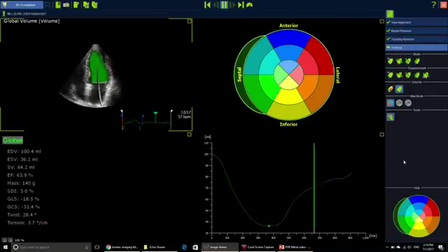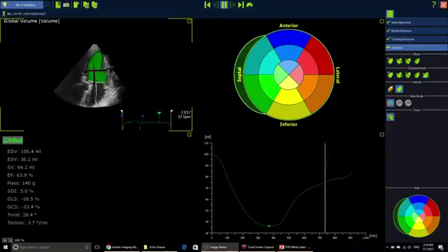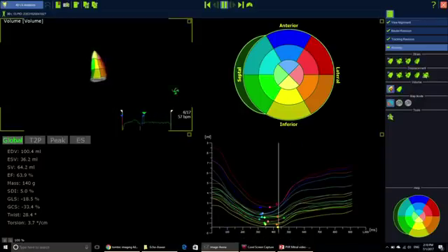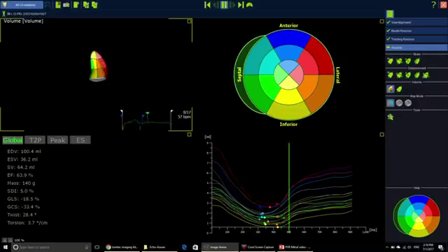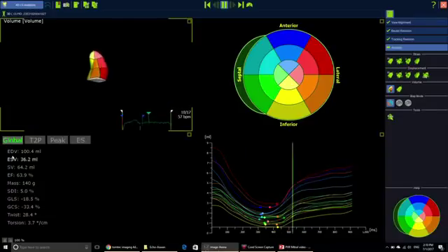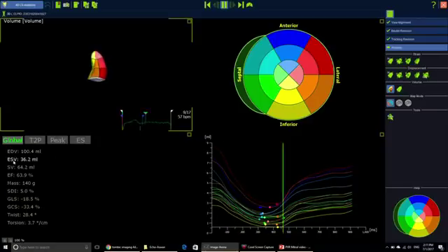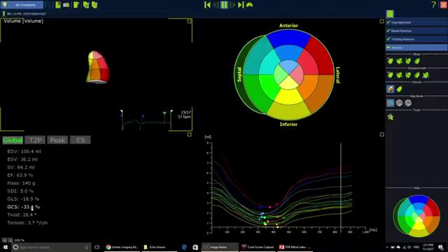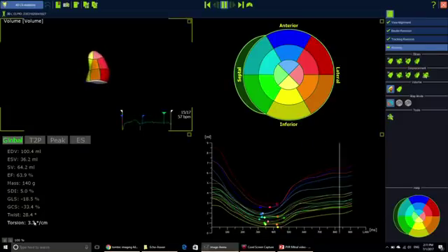Everything has been calculated. This is the volume, and if you don't need to see the black and white this is the cast alone. You can click this to see each segment individually with a different color, and here are the volumetric curves for each particular segment. These are the global results driven from 3D speckle tracking. The volumetric measurements include: end-diastolic volume, end-systolic volume, stroke volume, ejection fraction, mass, and a synchrony index of 5%. Global longitudinal strain was minus 18, along with circumferential strain, twist, and torsion.